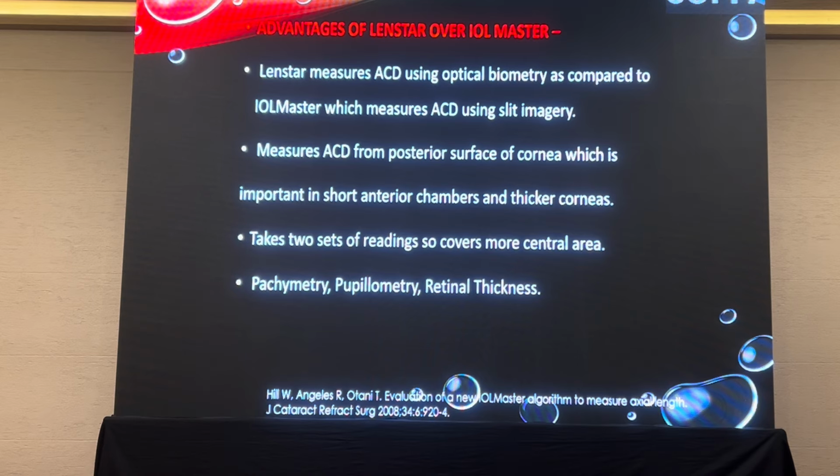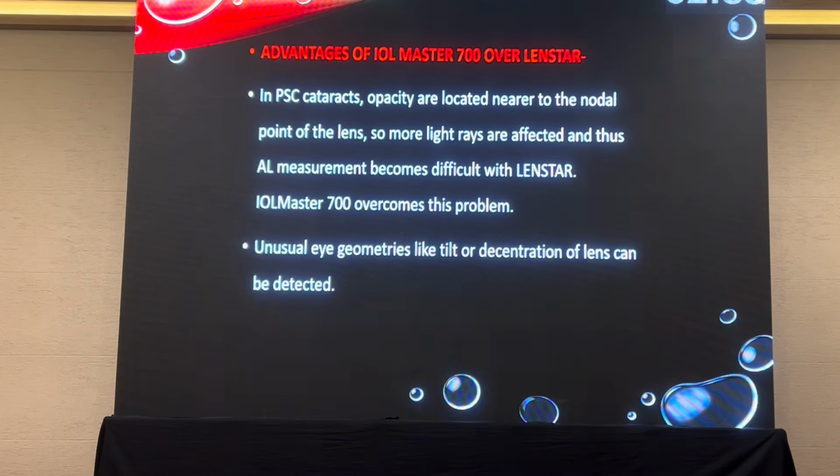Lenstar actually uses optical biometry to measure the anterior chamber depth, whereas the IOL Master uses slit imagery. And the ACD measurement in the Lenstar is from the endothelial surface, and two sets of readings are taken.